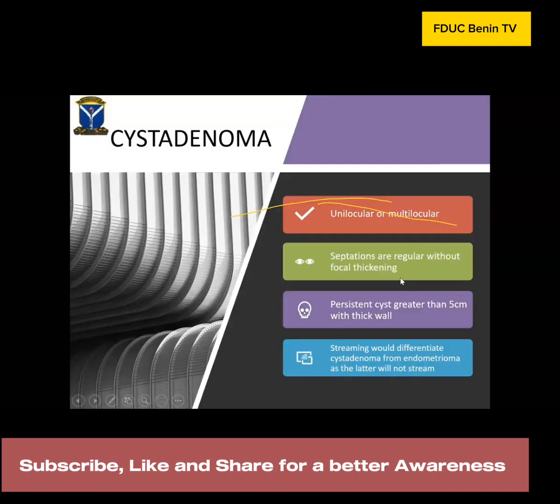Cystadenoma can be unilocular or multilocular. Serous cystadenomas are usually unilocular, and the contents are usually clear, anechoic.